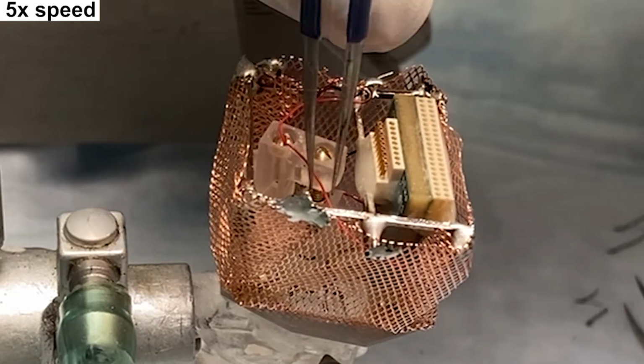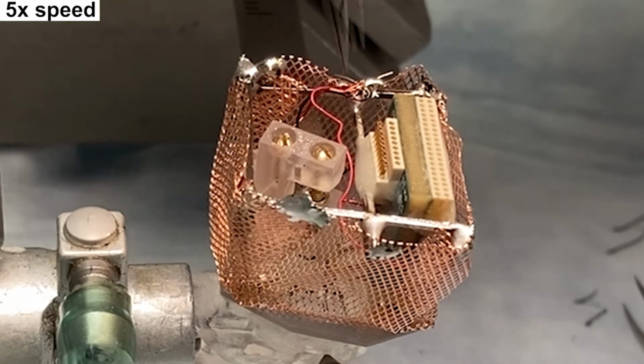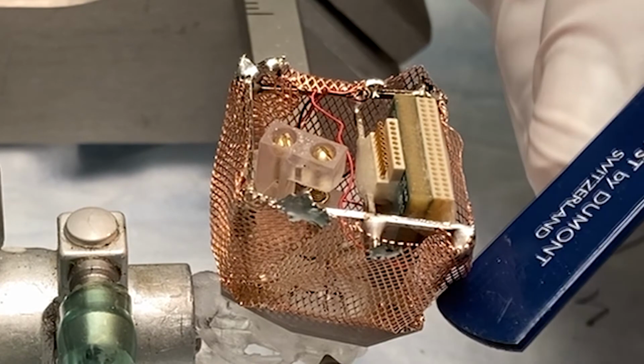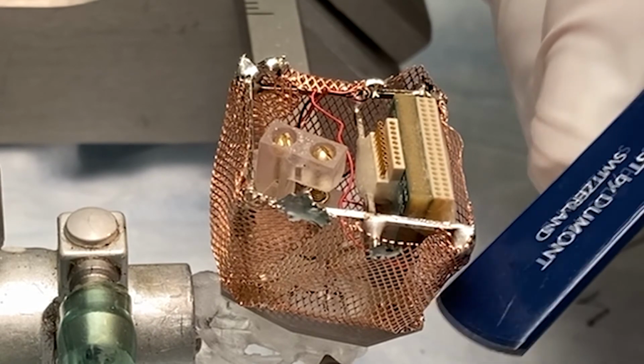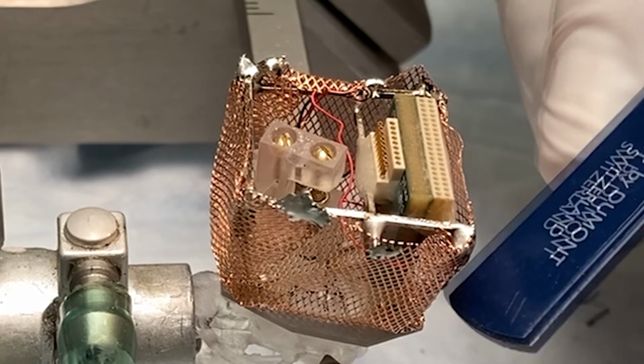And as a final step, you can use your tweezer to smooth the edges of the copper cap. So for example, you could see here there are some sharp edges. And if the animal scratches into those edges, they can hurt themselves. So you just gently want to make sure that there are no sharp edges all around.